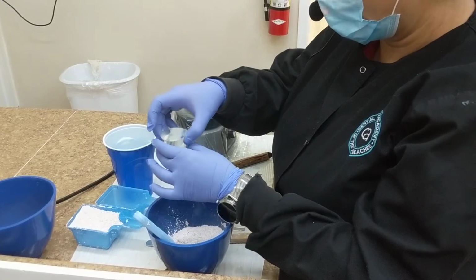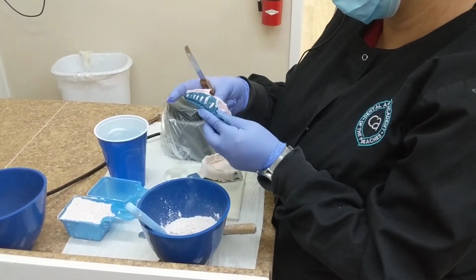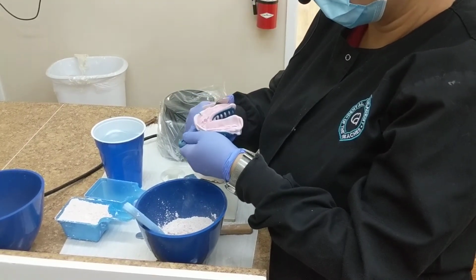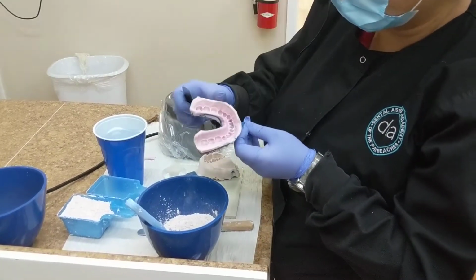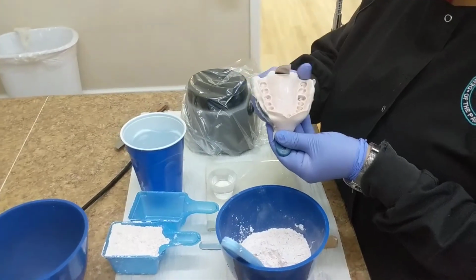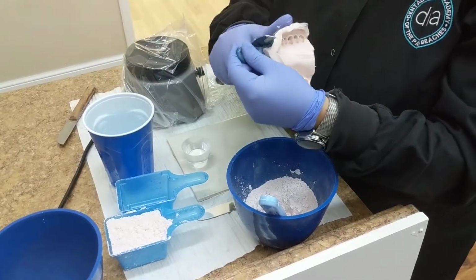But before I do that, I'm going to trim any excess of material that I have here. Right now I'm cutting the tongue part off. You don't always have to do that, but here at the school we will, because we need to create a temporary crown on this little tooth that's cracked. So I'm just removing some excess off. It's just like peeling a potato. Okay.